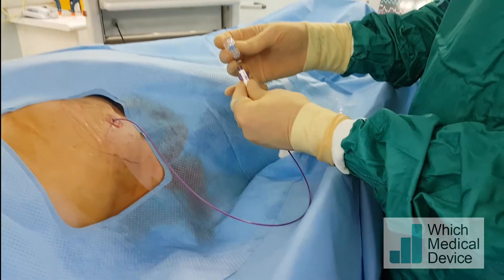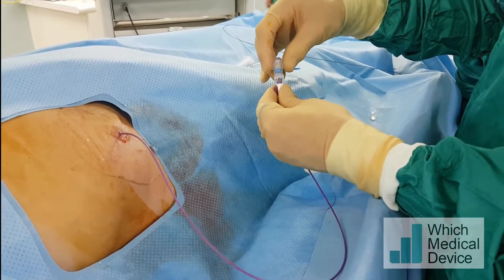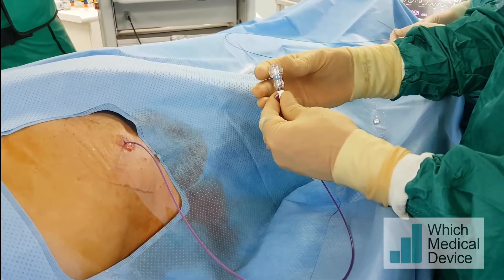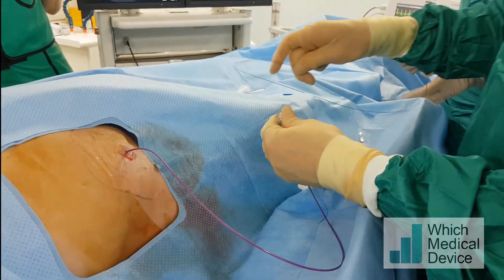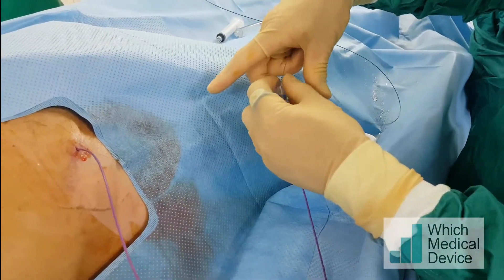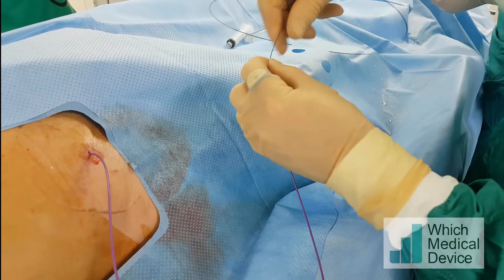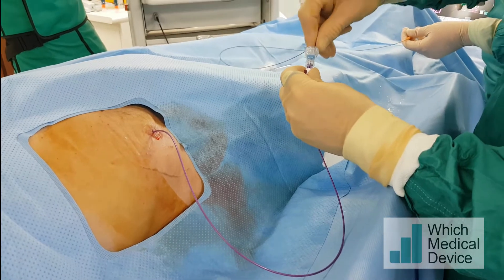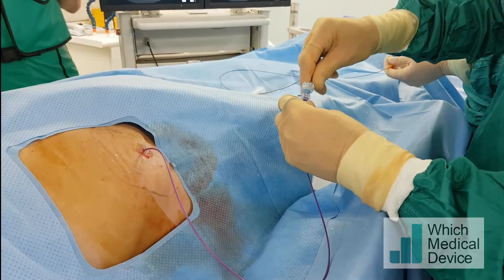We're putting one of these Flow 30 valves — it's a bit like a Tuohy-Borst — onto the end of the catheter; this is also made by Merit. This will allow me to grip the micro catheter and stop it backing away as I'm advancing the guide wire. I can tighten that valve to give a little more resistance and adjust it to as much resistance as I like.